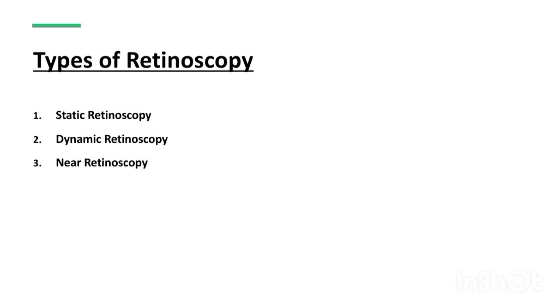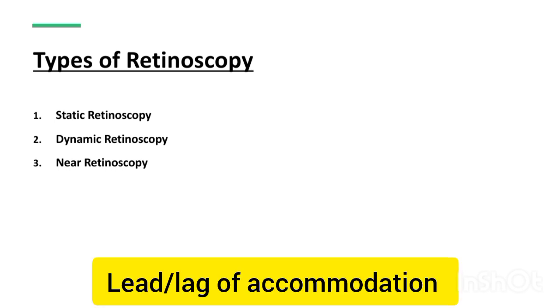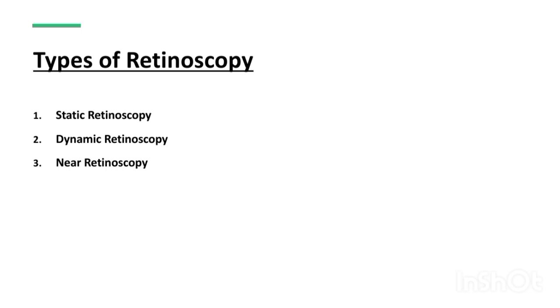Dynamic retinoscopy has no relation with the power. It is to find out the accommodative lead or accommodative lag of the patient. For dynamic retinoscopy there is another video.